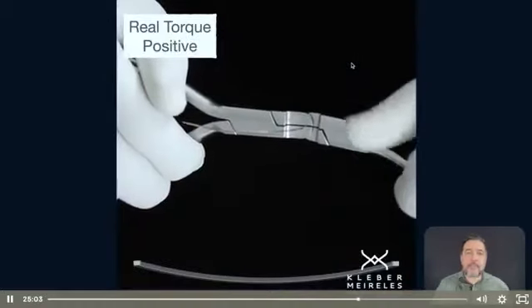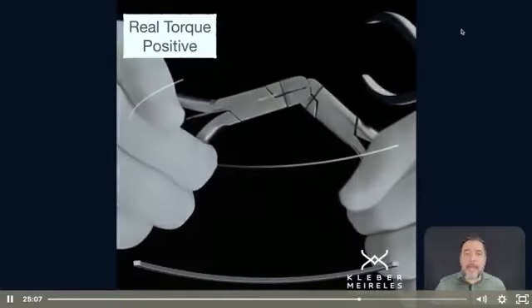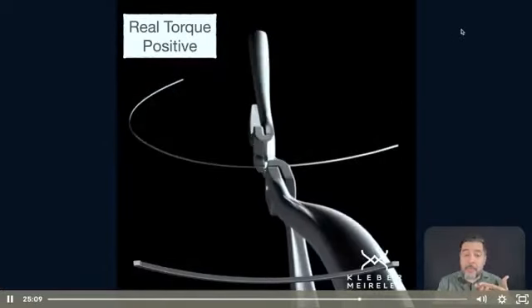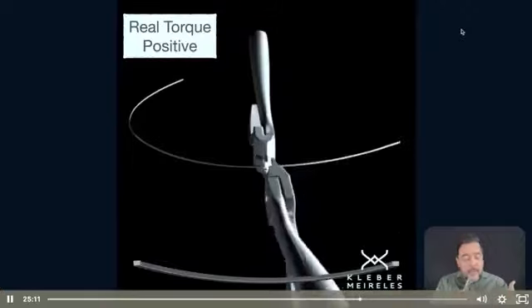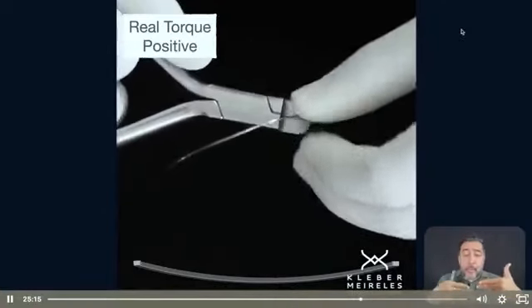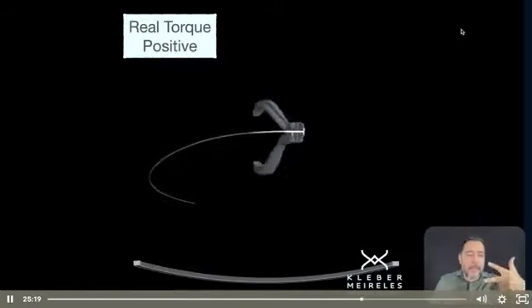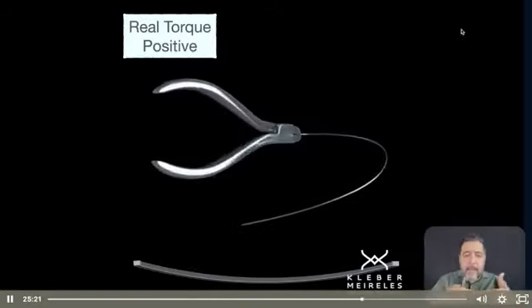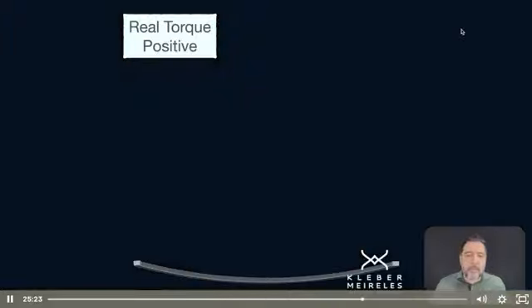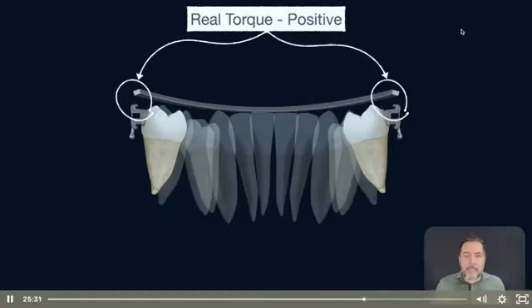Here it is. So this is the way we apply the torque with two pliers, twisting the posterior segment. The anterior segment is just to support the torsion of the posterior segment. So we have the plier to support and the plier to do the torsion, giving this torsion in the posterior segment. And at all times we must adjust, okay?